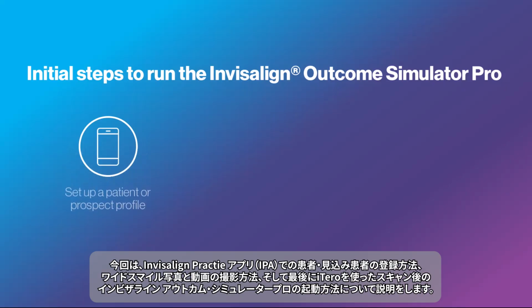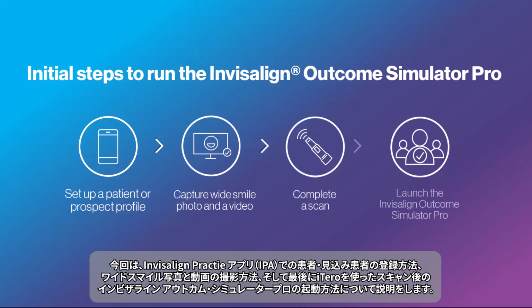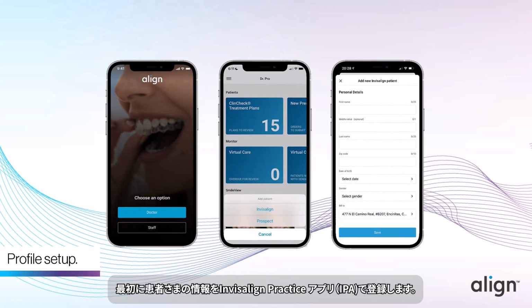We'll cover how to set up a patient or prospect profile using the Invisalign Practice app, capture a wide smile photo and a video, complete a scan, and launch the Invisalign Outcome Simulator Pro. Let's start with the patient profile setup.